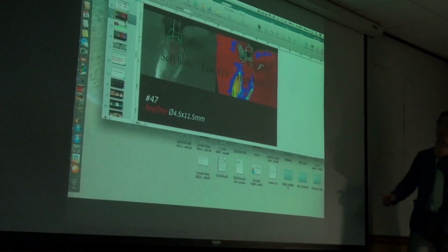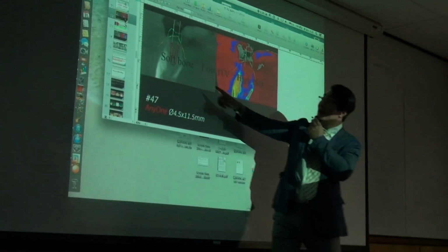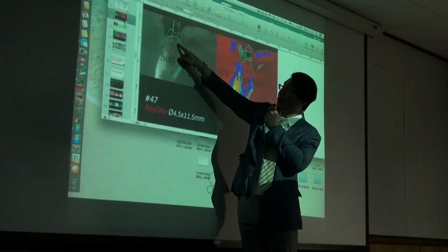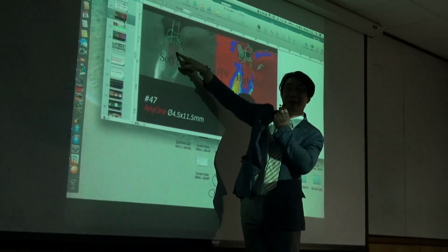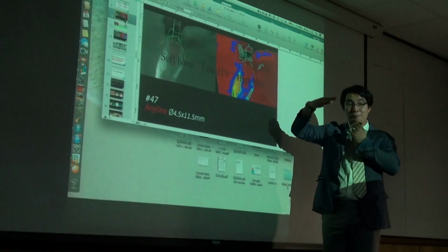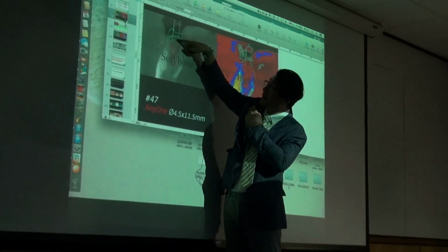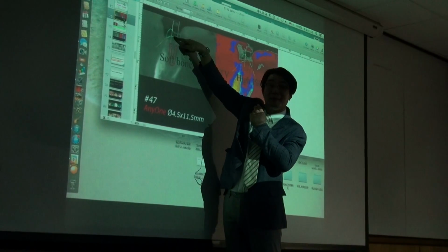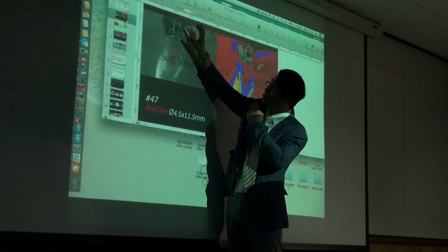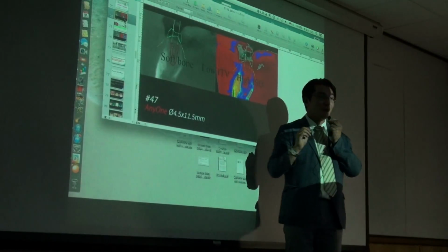How about this case? The previous case. In this case, I placed the implant deeper, right? So this implant was placed infracrestal to the bone, and when we connect the smart pegs, it is relatively shorter than the bone crest. It's a simple way: I'm tall.